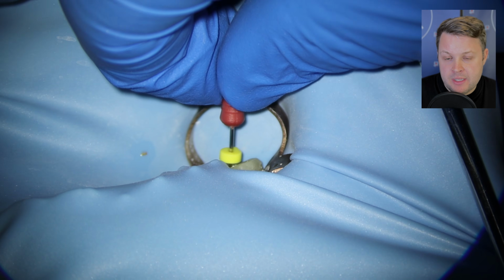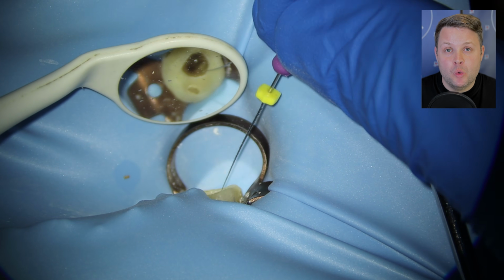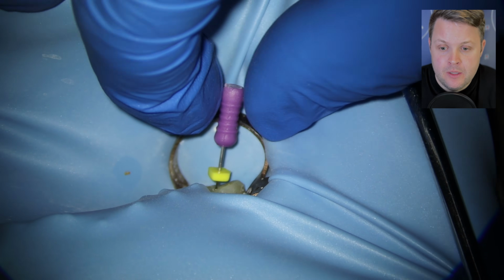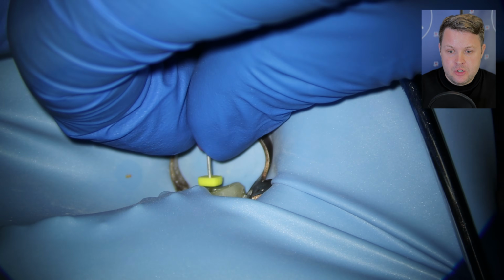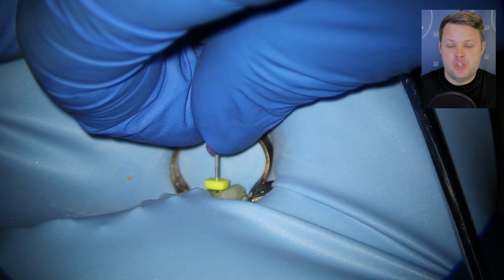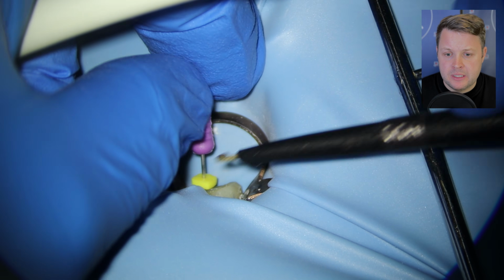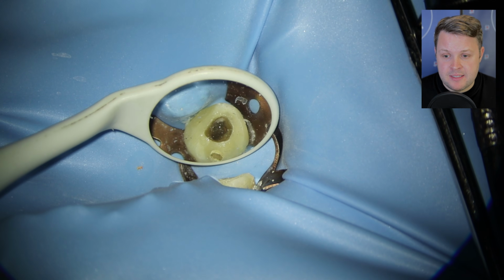More than likely, the reason it's not going all the way to 0 in this case is either there is complicated anatomy, or some of the sealer blocks the end. So I'm being really careful here with the size 10 K file. It's super easy to fracture these files, so you just have to be really careful. Again, I'm putting the apex locator on, and I'm definitely not getting to 0.